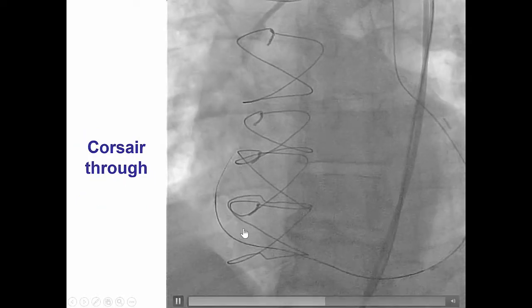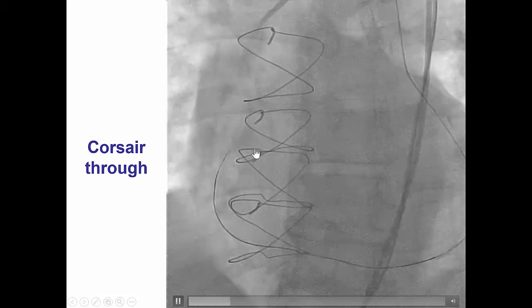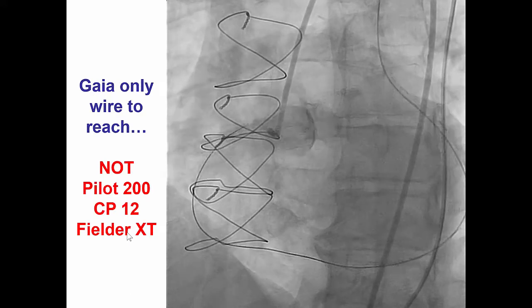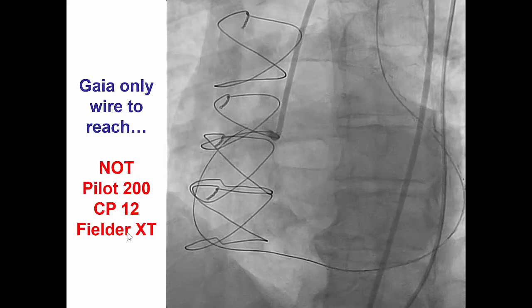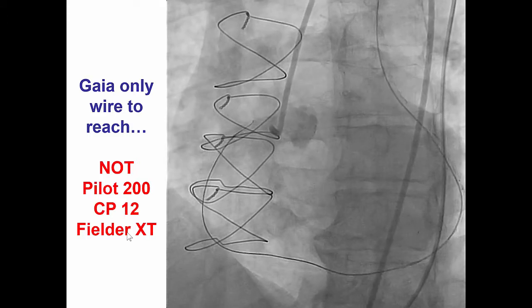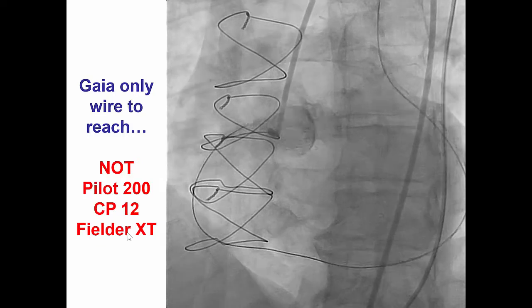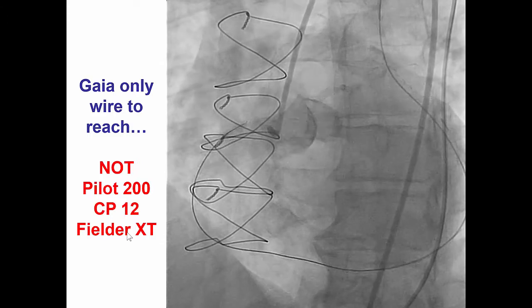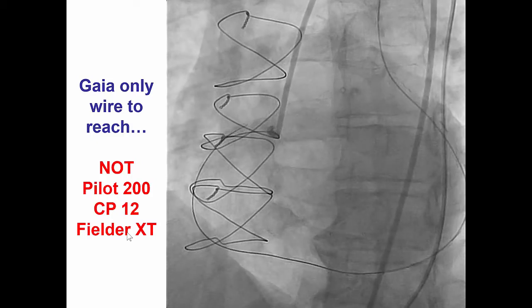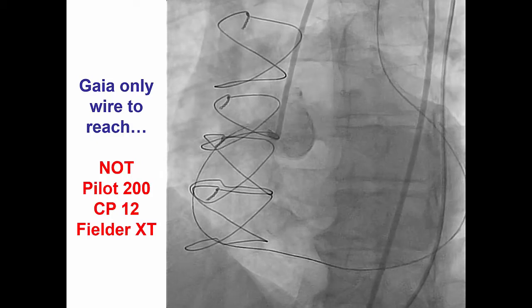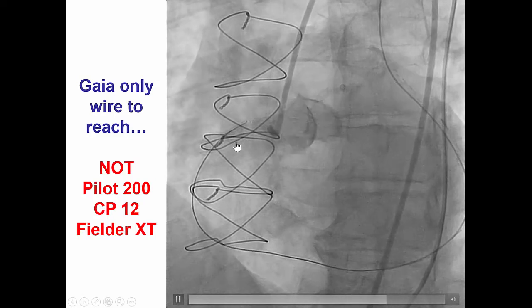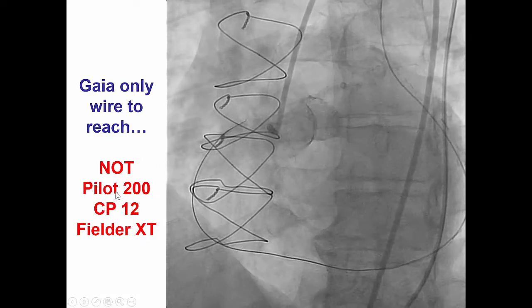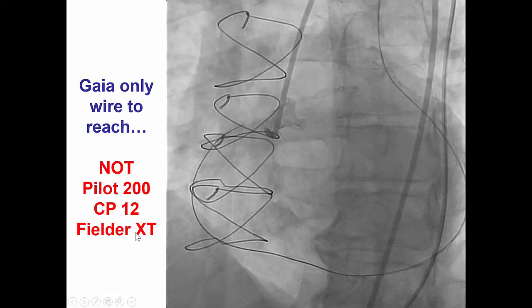We were able to advance the guidewire essentially all the way to the proximal right coronary artery stent. However, we then encountered significant difficulty advancing wires through the last few millimeters of the proximal RCA occlusion. This is not uncommon for in-stent restenosis when the tissue can become very fibrotic or calcified and very hard to penetrate. The other problem was that we had to go through the LIMA, and given the tortuosity the wires had to navigate, by the time wires arrived at the tip of the Corsair catheter, there was no torque left. We could not literally reach the distal part of the Corsair with the Pilot 200, Confianza Pro 12, or Fielder XT guidewire.